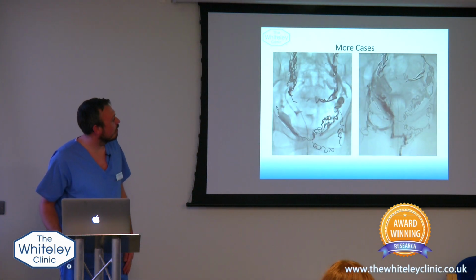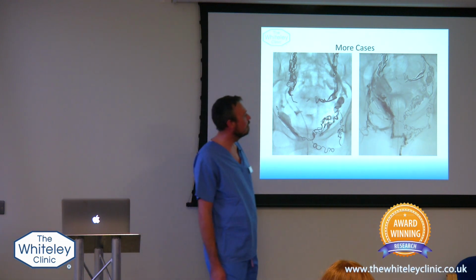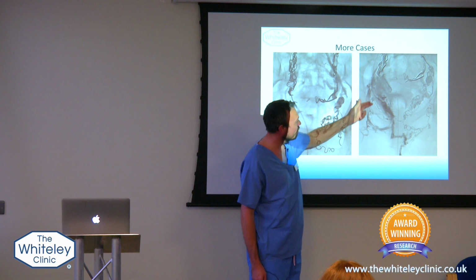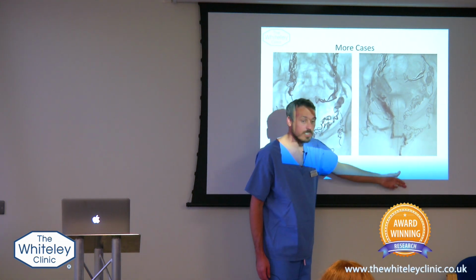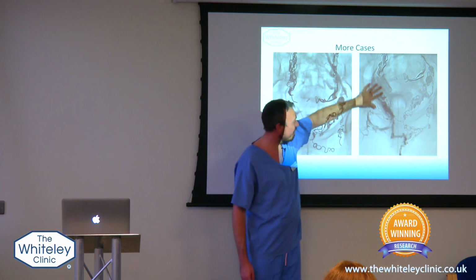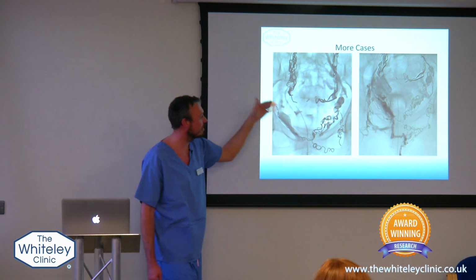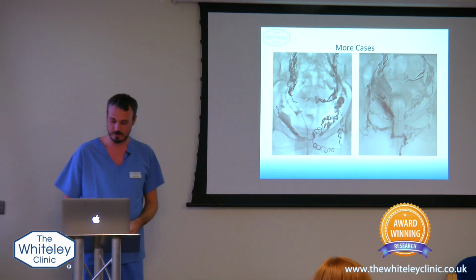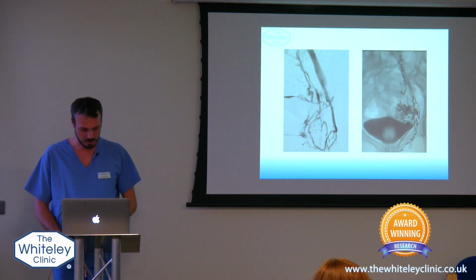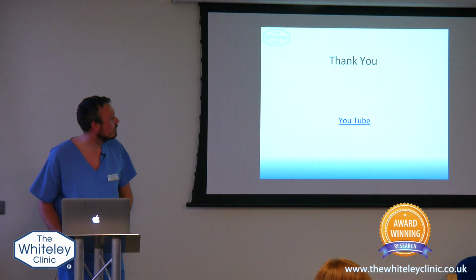We're talking about lots of coils. This is probably one of the most that we've seen. Here I'm injecting contrast. What's black is dye. You can see it spilling down through the vulval veins and down onto the leg. So you can definitely visualize what's happening during the procedure. You can actually see the contrast, you can see the veins, you can see where it's going. And these are just more pictures showing the network of the veins.